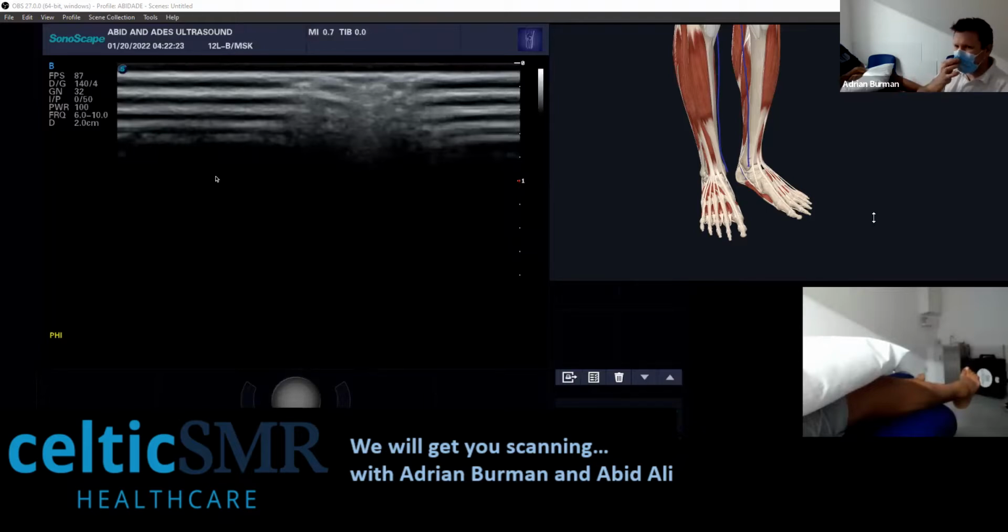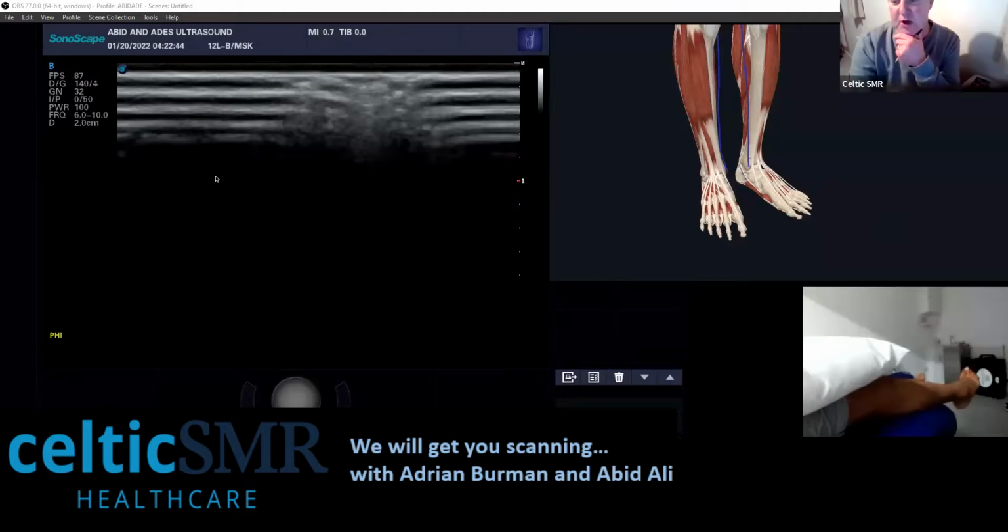Because it's just changing the colour of the image to something that's not always grey, black and white, the chroma setting is really good if you're looking for real subtle changes. Thank you, Sandra, otherwise known as Chris.